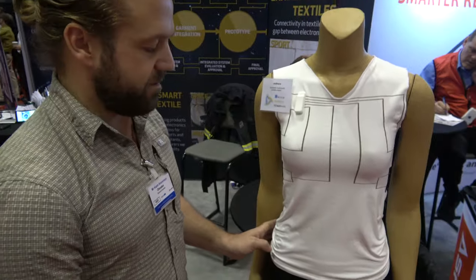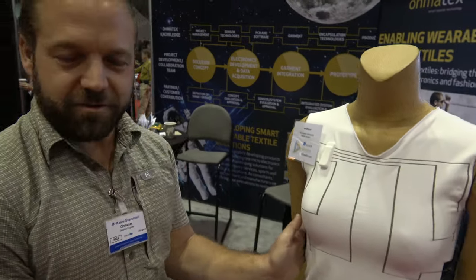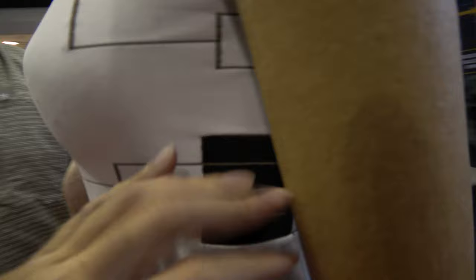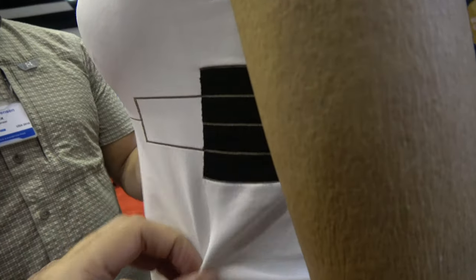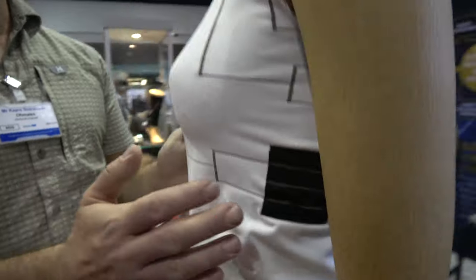This is for people with scoliosis problems, mostly teenagers and young girls. The pressure sensors on the side measure whether you're holding the right position. If you're working against the brace, you can do exercises during the day with an app and see how it's working.